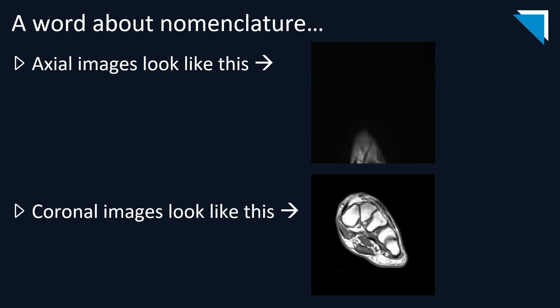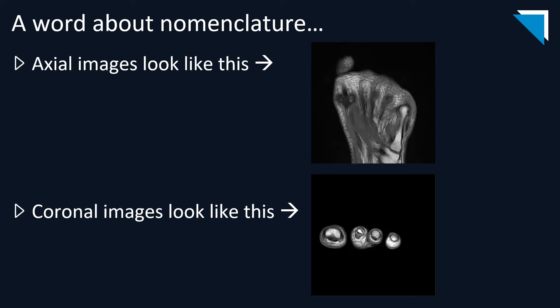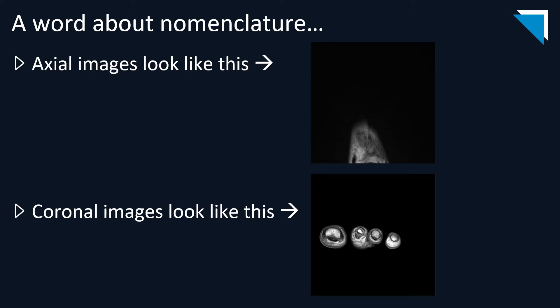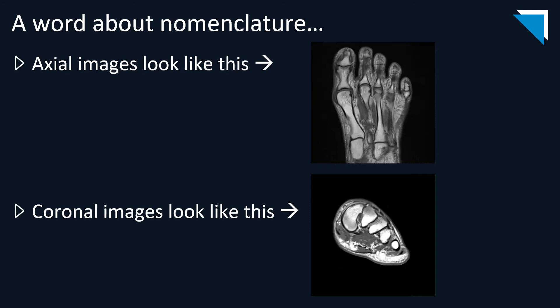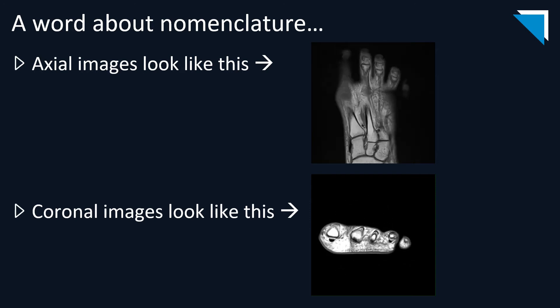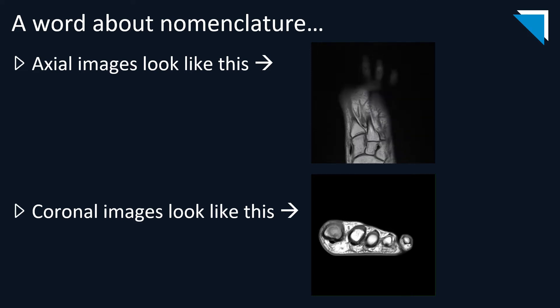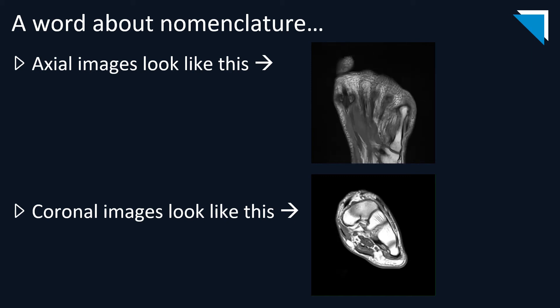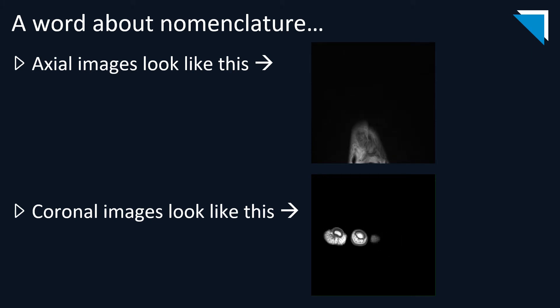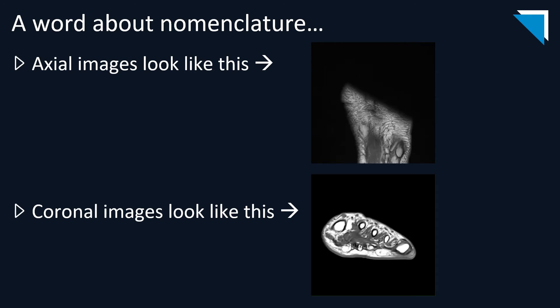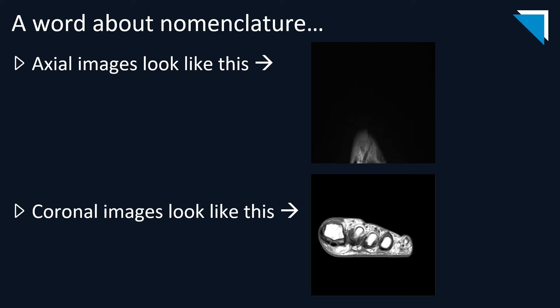Just a brief word about nomenclature, because I do frequently see the MRI sequences mislabeled by the text. This top sequence is an axial sequence, and you can orient yourself by imagining the MRI scanner slicing through the lower leg in the axial plane and continuing through the ankle and the foot in the neutral position. Likewise, the bottom sequence is a coronal sequence — you can orient yourself by imagining the MRI scanner slicing through the lower leg in the coronal plane and continuing through the ankle and foot in the neutral position. You can avoid confusion altogether by simply referencing series numbers in your reports for pertinent images.